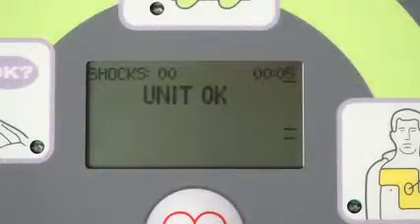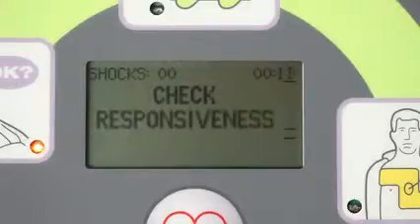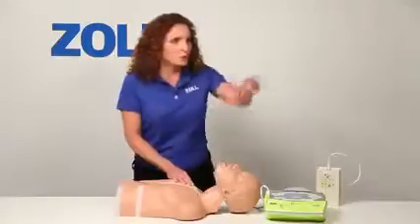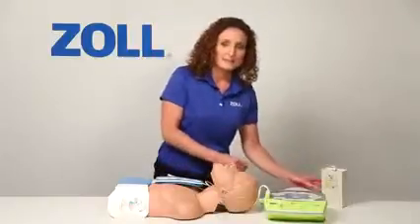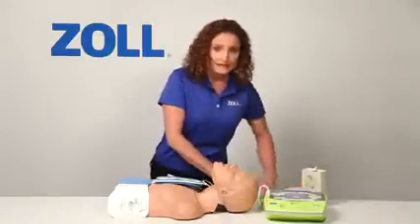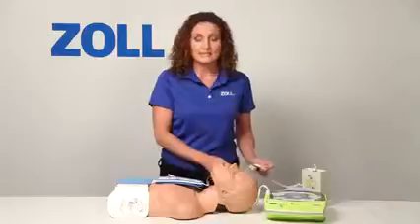Unit okay. Adult pads. Stay calm. Check responsiveness. Call for help. Are you okay? You! Go call 911. Attach defib pads to patient's bare chest. I will set the simulator to present asystole, an unshockable rhythm. When I plug it in, the AED Plus recognizes the presence of a heart rhythm and begins analyzing it.